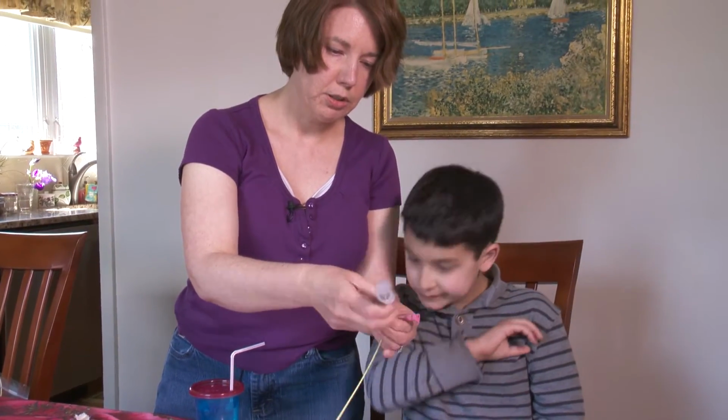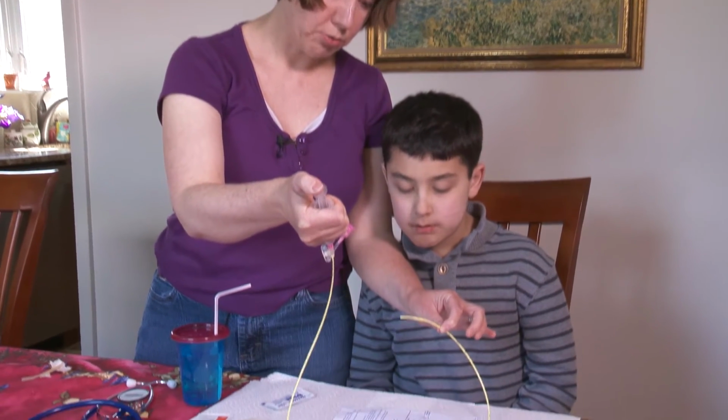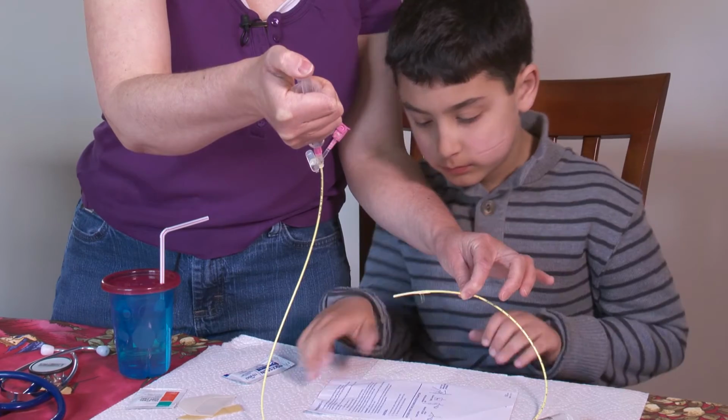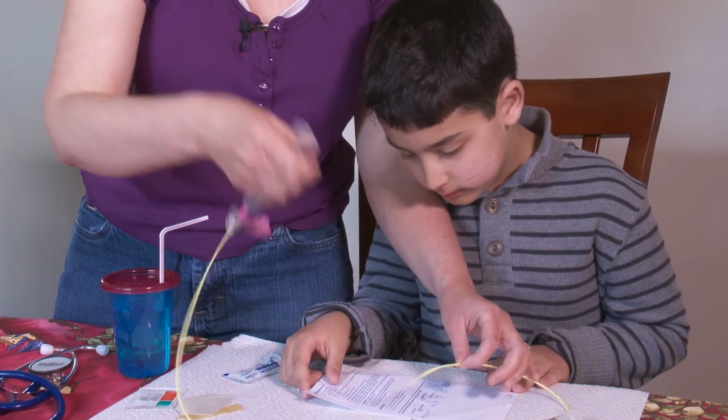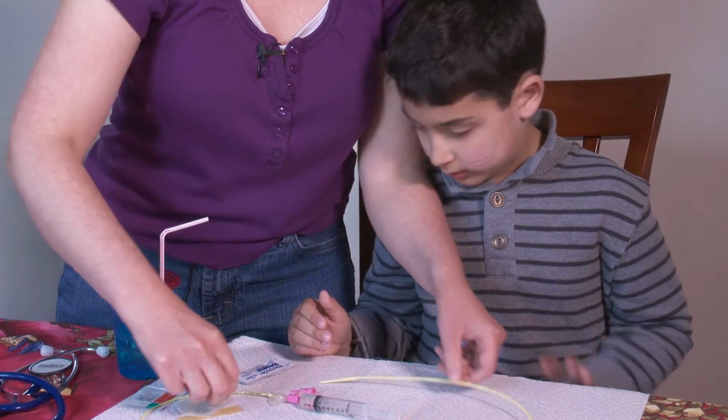And I'm going to flush it through the tube to make sure that a drip of water comes through my tube and it doesn't have any holes in it, and that it's patent, it's working. There you go. See, I got a drip of water through my tube. That also lubricates the guide wire a little bit, so it's easier to pull the guide wire out when you're done with it.